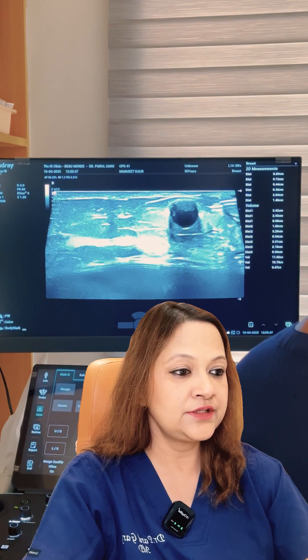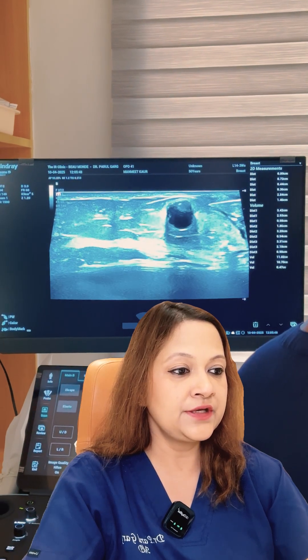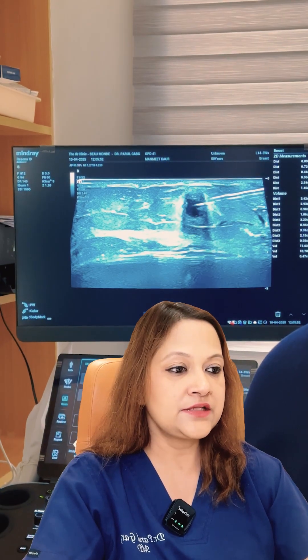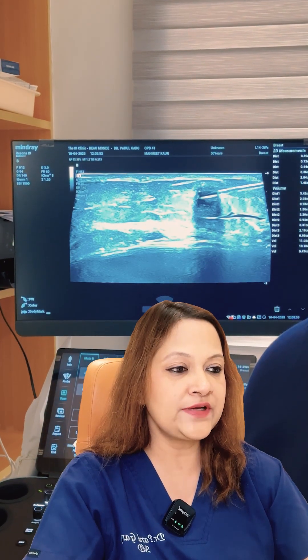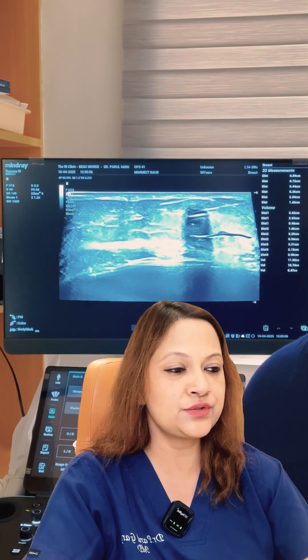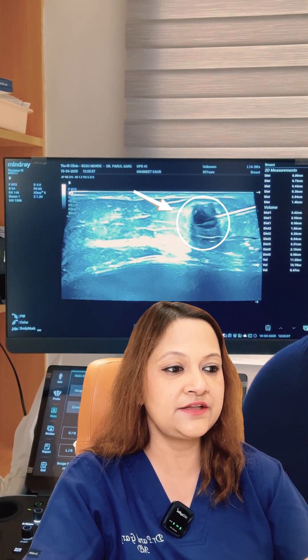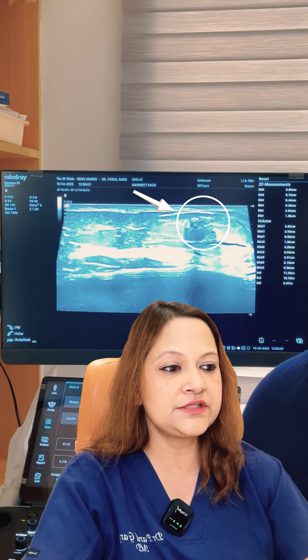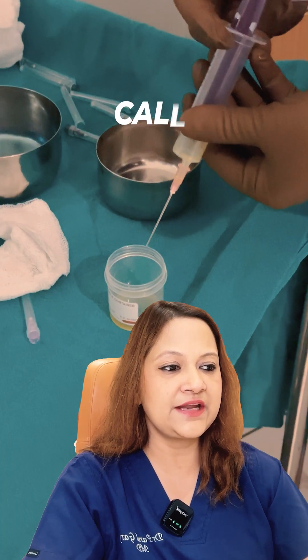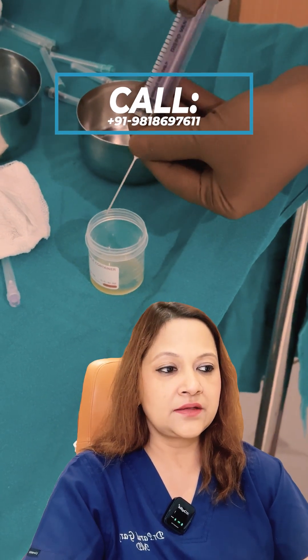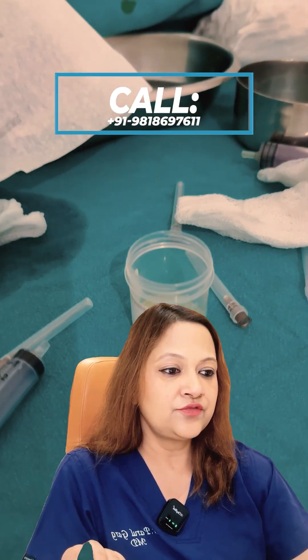You can see the needle piercing the cyst and I am aspirating it with a syringe. The cyst is completely emptying — it is reducing in size and then it disappears completely. I then withdraw the needle. This is the fluid content which we had aspirated.